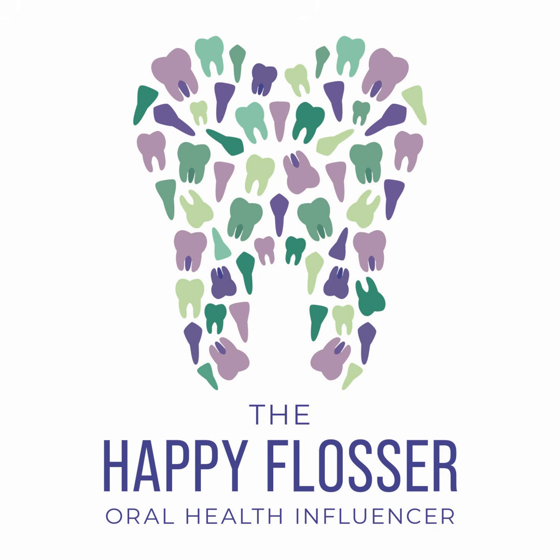And then the location of it tells us a lot about the type of diseases that are present. So is it in the maxilla, is it in the mandible? Is it in the sinus or the soft tissues? Is it back around the wisdom tooth? And how does the surrounding tissue respond? What's the effect that that lesion is having on the teeth? Is there displacement of a tooth? Is there resorption of the root? Is there a change in the eruption? Is the tooth super erupted?